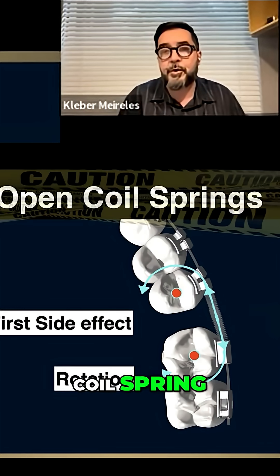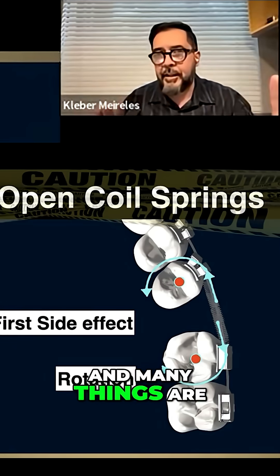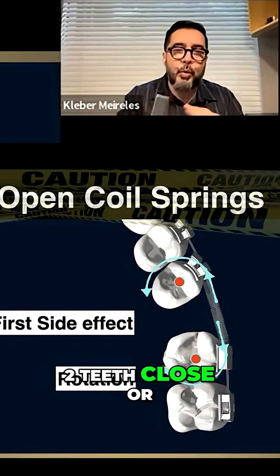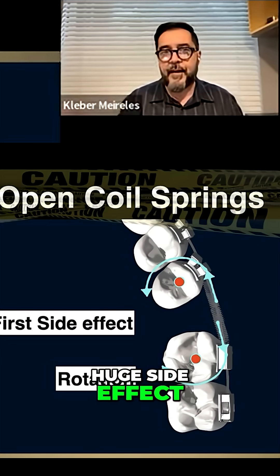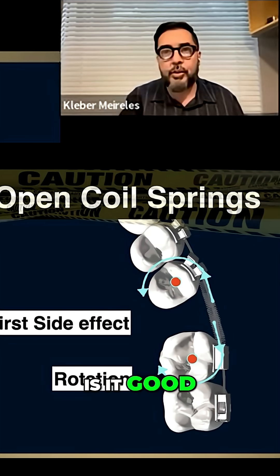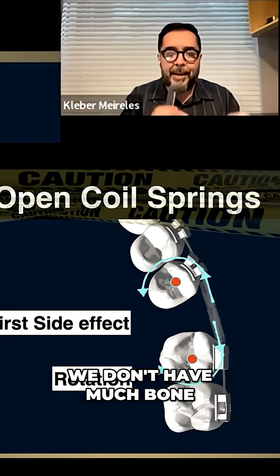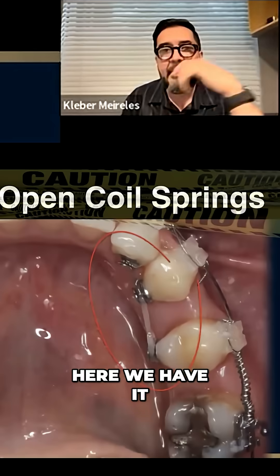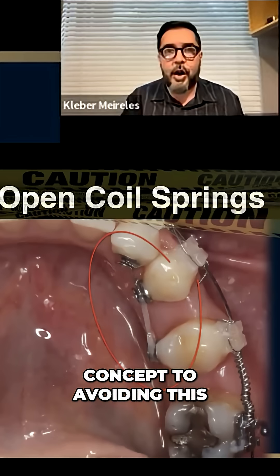As you can see here, the contact points will act, and many things are going to act mainly in those two teeth close or attached to the coil spring — we're having this huge side effect. Rotation: is it good? No, it is not, especially for the premolar. Especially in this area we don't have much bone support. This rotation of the premolars — I can use another concept to avoid this kind of rotation.